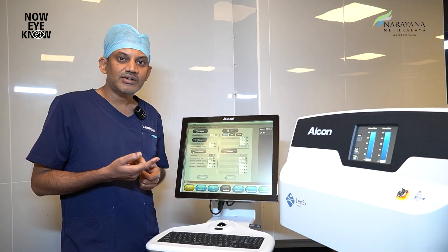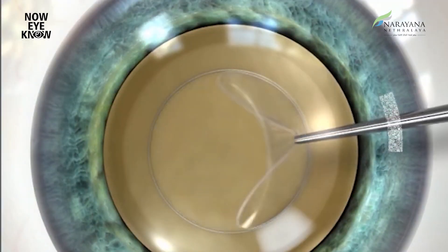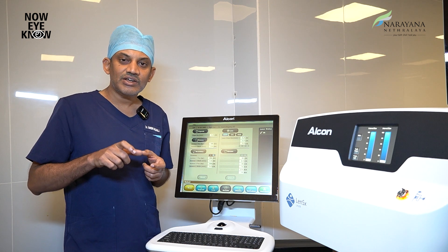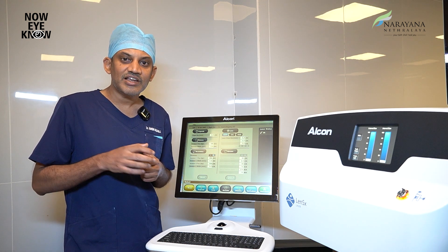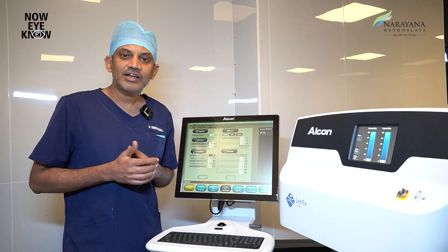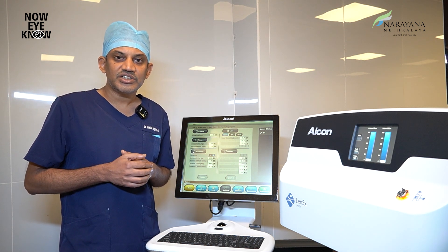The second advantage is the opening in the bag, also called capsulotomy. This can be centered exactly in the bag. Centration plays a very important role when we are placing your lens inside, and once the lens is centered, you are bound to get much better and clearer vision.